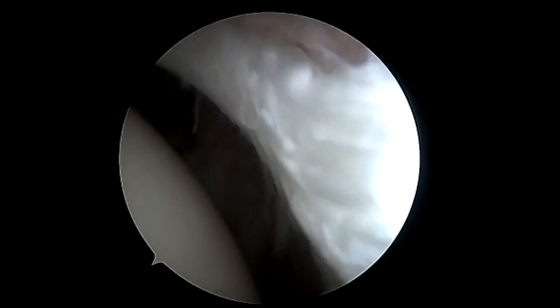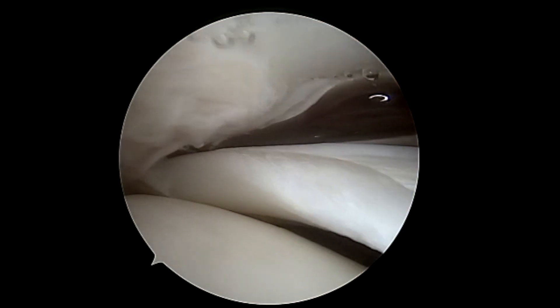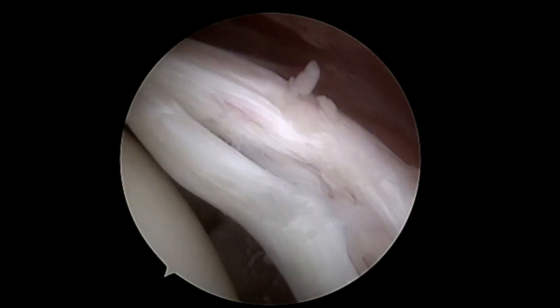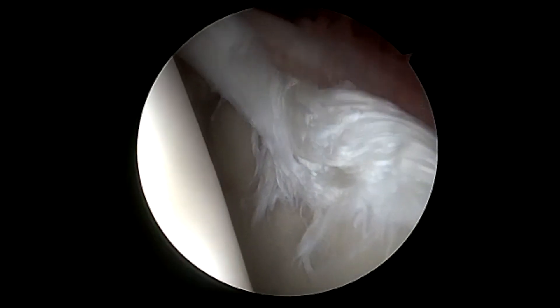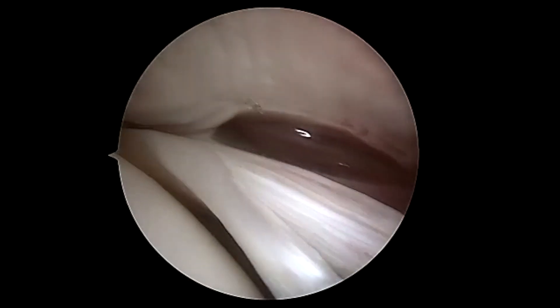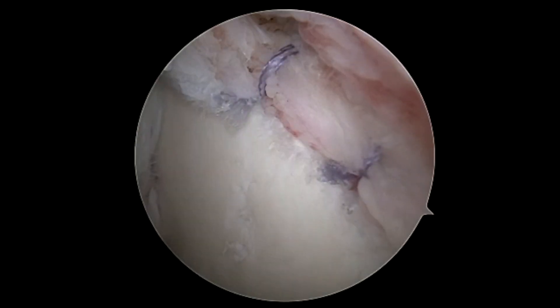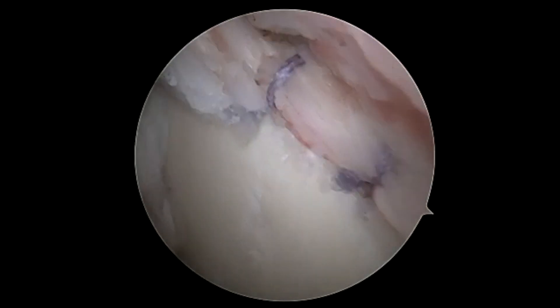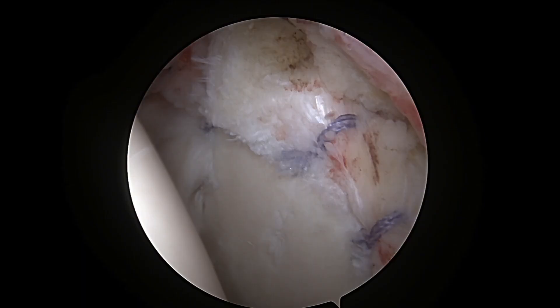In this surgical video, I am inside a patient's joint. On the left side is the ball — the humeral head. On the right side is the labrum and the socket. Here you can see this severe tearing of the superior labrum — this is a SLAP tear. In this situation, it is so severe that the tear extends all the way up into the biceps tendon. In this surgical procedure, we performed a biceps tenodesis, removing the torn piece of biceps from the joint and fixing it outside of the joint.